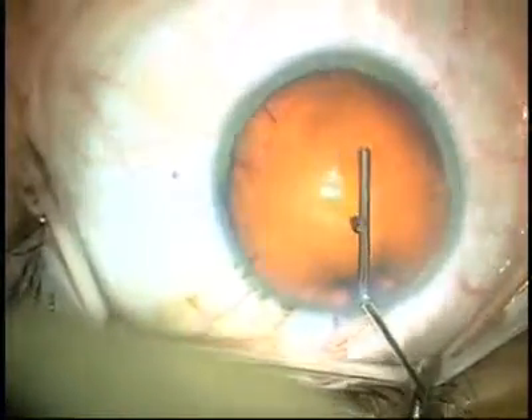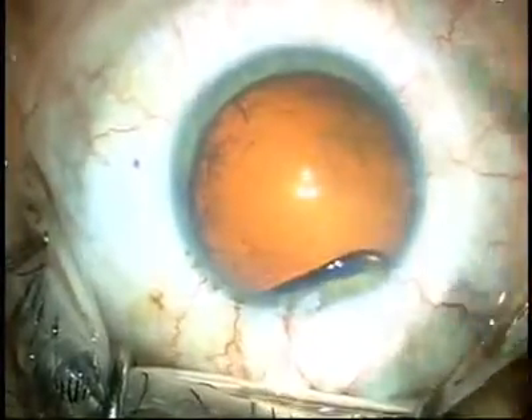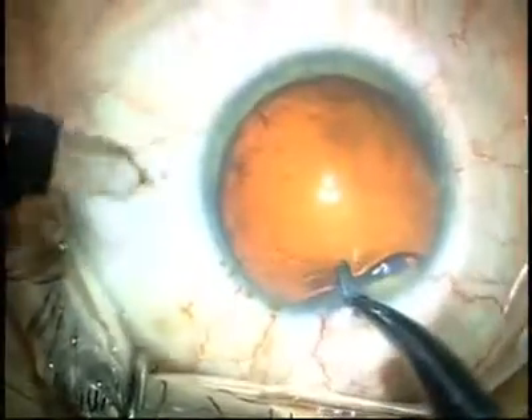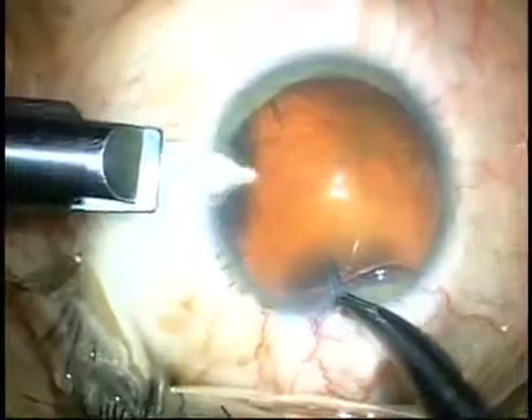When we inject the Helon into the anterior chamber to create another soft shell technique, you'll notice that the irregularities peripherally smooth out and we create a relatively smooth undersurface for the viscoelastic. The anterior chamber is quite stable making the main incision.